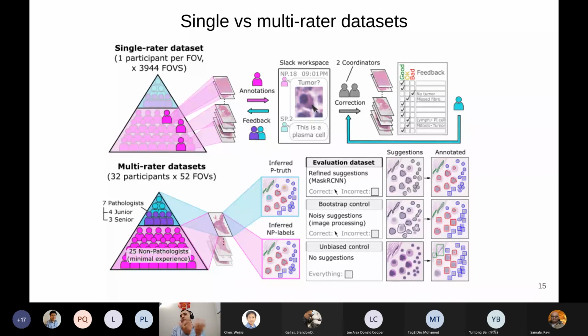So there's two purposes here. We're comparing people, seeing where are the outliers from the non-pathologist, or even from the pathologist, who are the outliers, and make sure we account for that. But also to infer, because we have many annotations from different people, one singular label from everything.